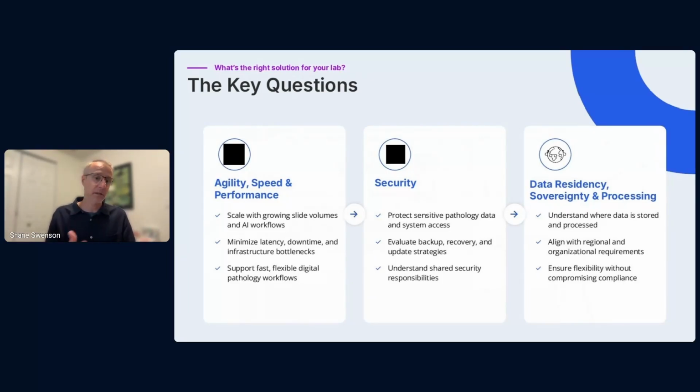As a clinical practice, it's something that, of course, you have to be thinking about, but you have to ask, is this something that you and your team want to be thinking about every day, or is this something that you'd like to have outside expertise handling for you? If you've got a robust security solution, then on-premise can be an option. But if you're not able to keep up with that, it becomes a liability.